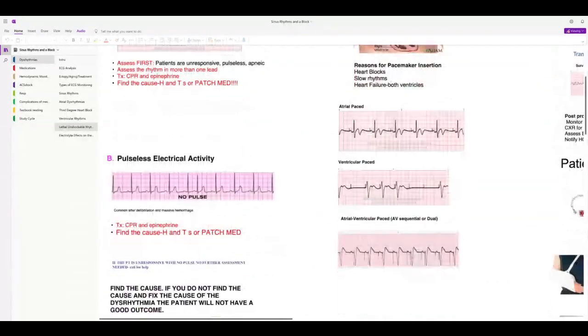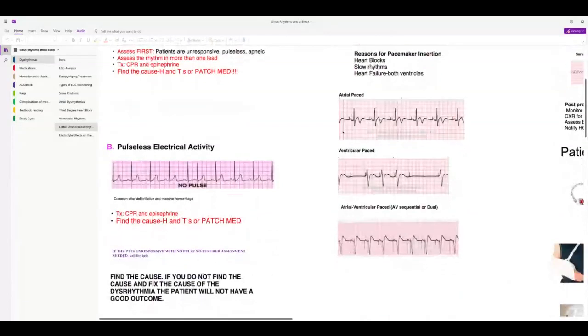So what has shown up on the proctor before, I'm just going to keep this super simple. When the pacemaker delivers electricity, there's a spike, okay? So this spike is coming before the P waves. So this patient is atrial paced. The atria are paced in this rhythm. In this rhythm right here, you've got a spike and then a QRS. So this is a ventricular paced pacemaker.